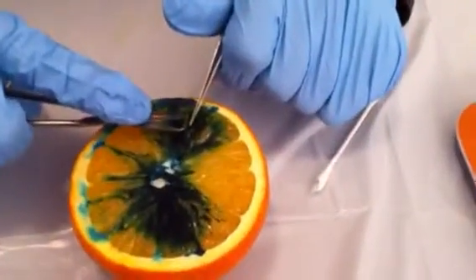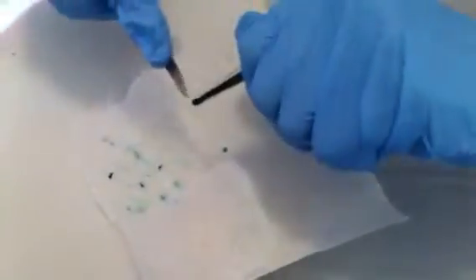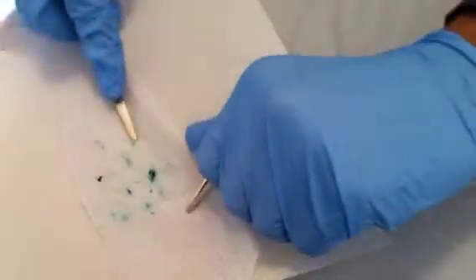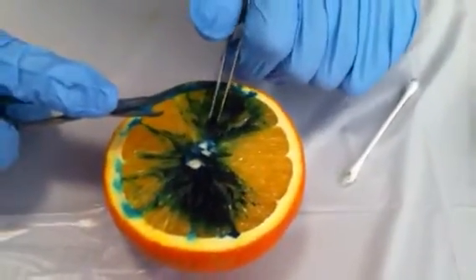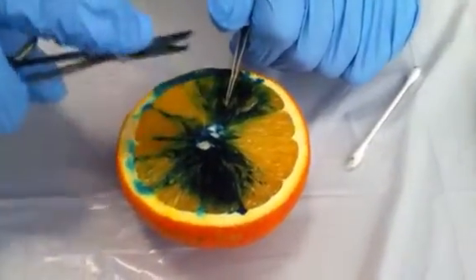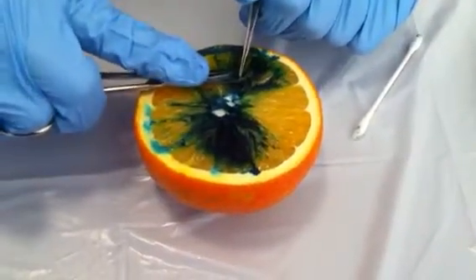So lift the tissue here. The middle third of the scissor here and there go the necrotic tissue. So I hold it, make a grip. I am trying not to cut with the tip — and here we go.